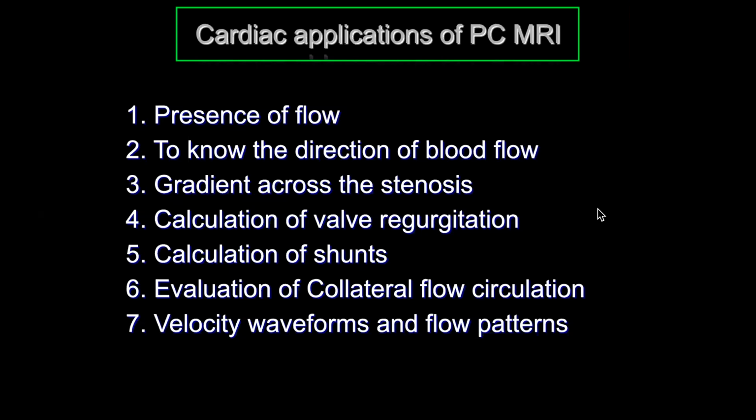The last question before you get back to your topic, Rajesh, is that there are a couple of different options for getting phase contrast. One is a single breath hold image, and the other is three sets of images where the patient is free breathing and you do an average to get phase contrast as well. Do you have a preference for one or the other? Do you find one works better than the other?